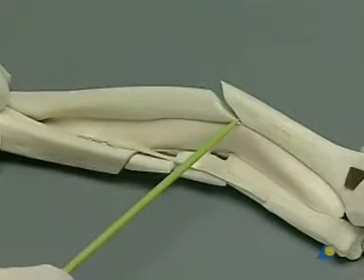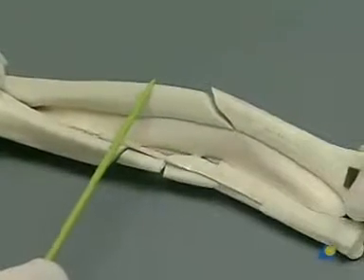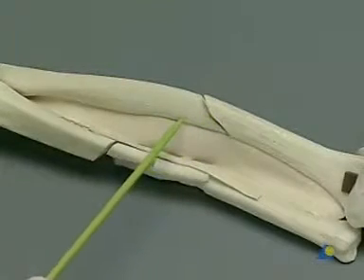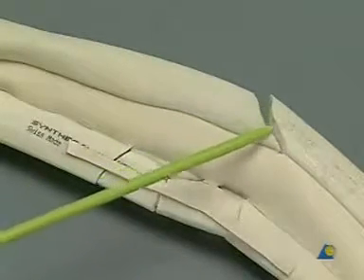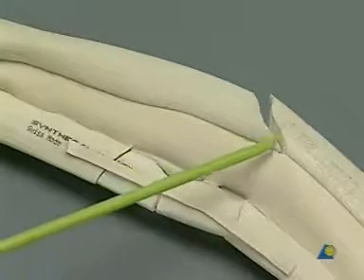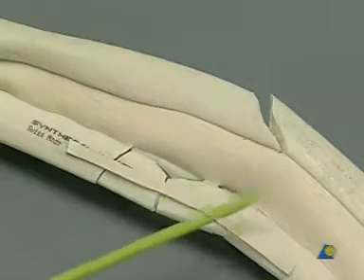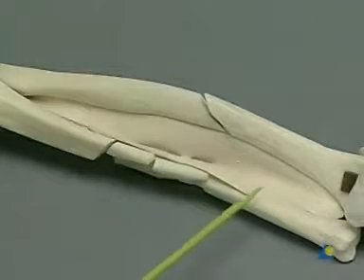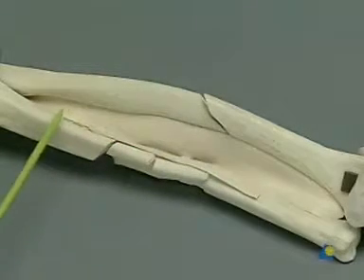The radial fracture, when reduced, will be held by a seven-hole LC-DCP, incorporating a lag screw. The obliquity of the radial fracture line will determine the siting of the plate and the sequence of screw insertion. Note the almost intact interosseous membrane. For the ulna, indirect reduction will be followed by fixation with a 12-hole LC-DCP used as a bridge plate.